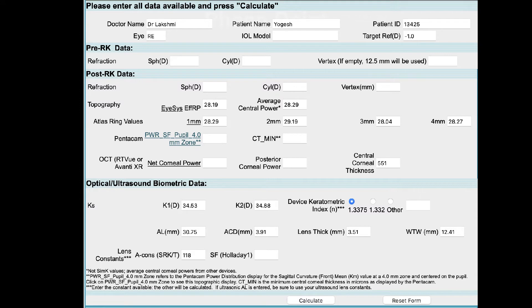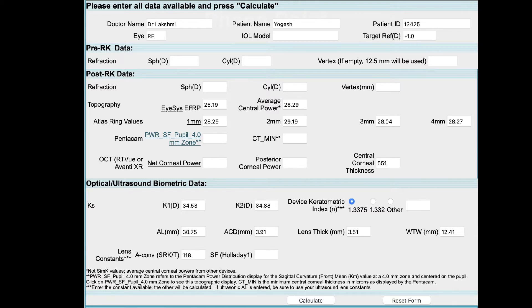The next section deals with pre-RK data. More often than not, this data is not accessible because the radial keratotomy took place many years ago. Note that this data is not mandatory for calculating on this site.